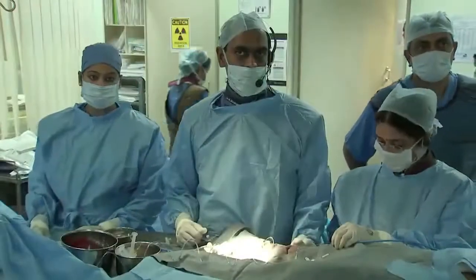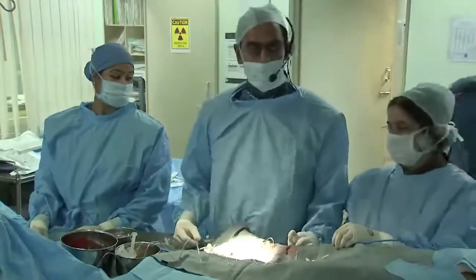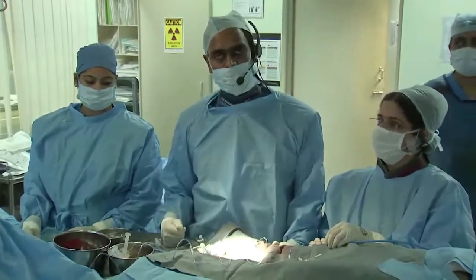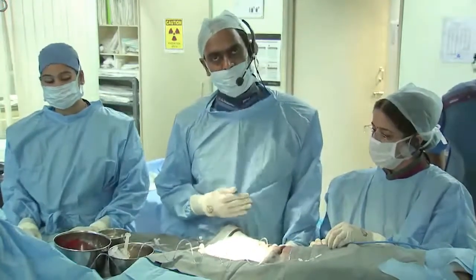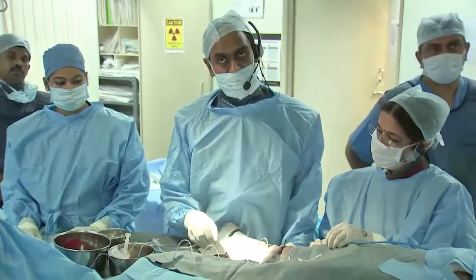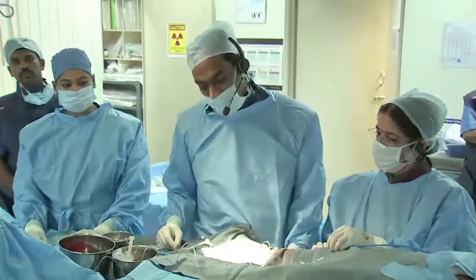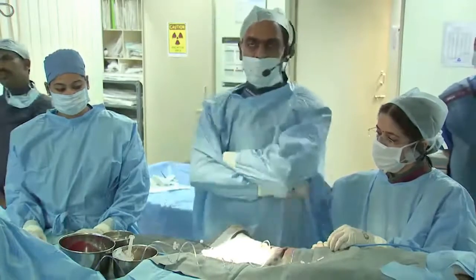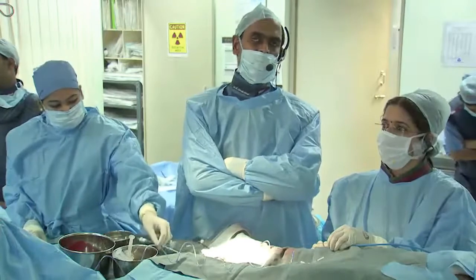Okay, we're now back in Chennai. Yeah. So what we debated was whether to use a 4 or a 6 or something in between. With the experience of a 4 mm device, even for that matter a 6 mm device, Dr. Joseph Vetticatil has observed thrombosis at the end of 3 to 4 months. As Dr. Locke was mentioning, if it is a 4 and the patient gets into trouble, it is always easier to put in a stent and try to open it out.